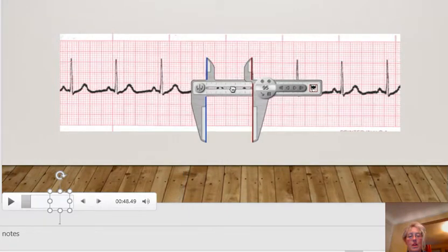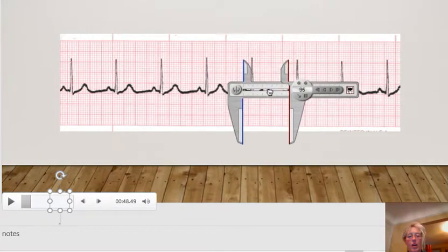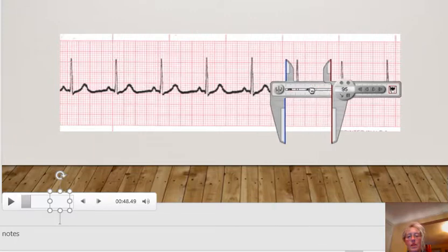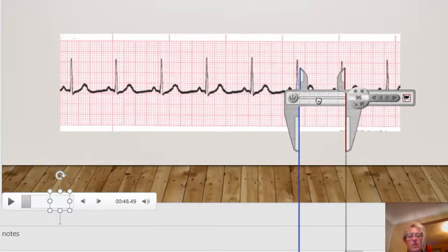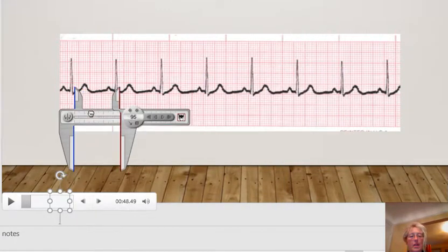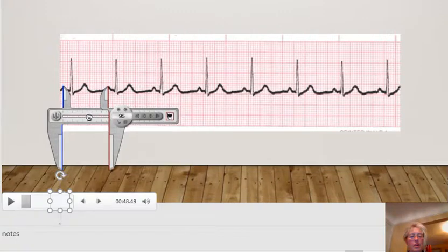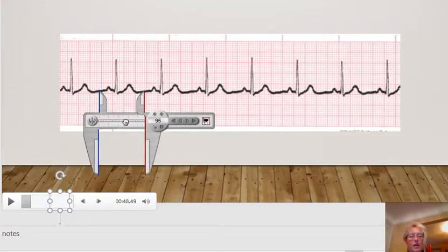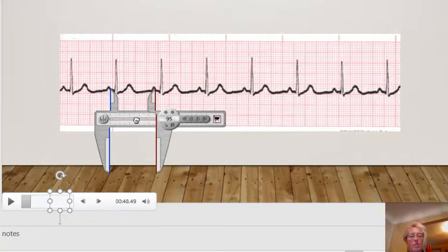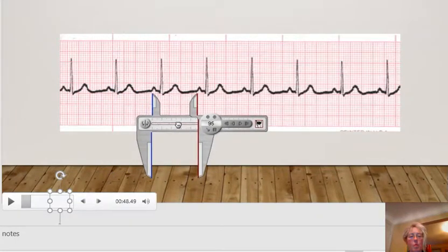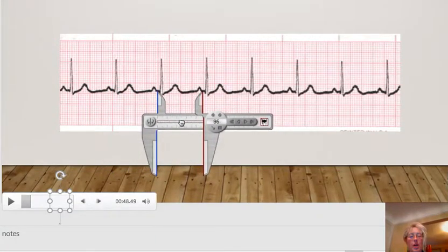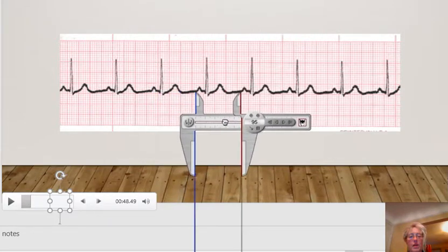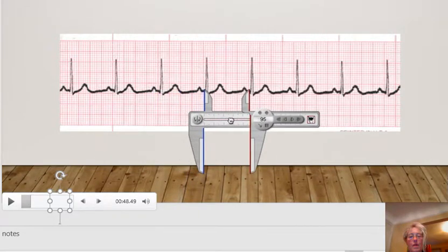So we see that our R complexes are regularly regular, which is always a good thing. We notice also that there is a P for every QRS complex and a QRS complex for every P. And that's what we want because the P waves originate where? In the sinoatrial node, right? That's where the heart starts to depolarize.